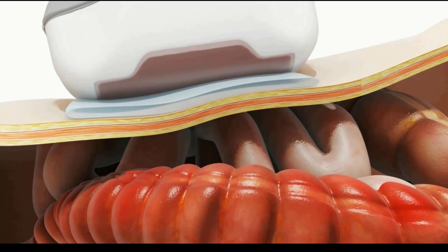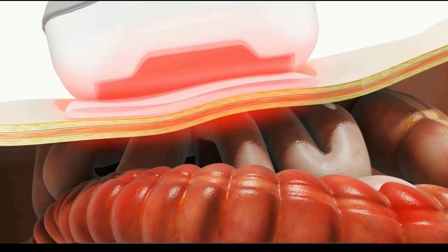Then molecules within the tissue absorb this light. Those molecules could be those like hemoglobin, melanin, collagen, lipid, could be an injected contrast agent, so long as it absorbs in the range of the laser. For the most part, we're using near infrared light for illumination, but that light energy needs to be absorbed by something in the tissue.